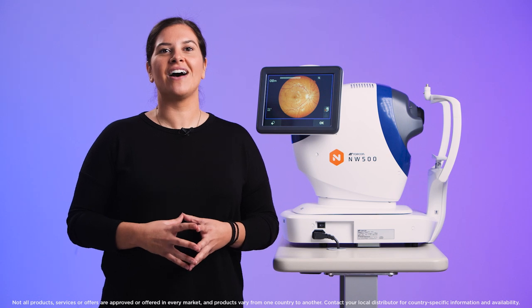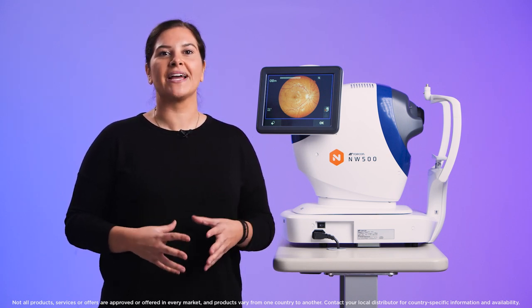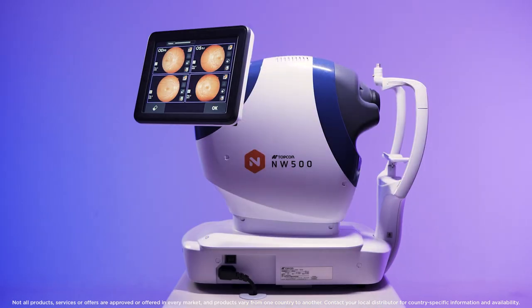Hi, I'm Mary from Topcon Healthcare University and I'm going to show you how to use the Dismacular Capture Mode using the NW500.